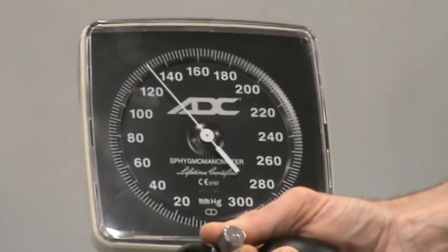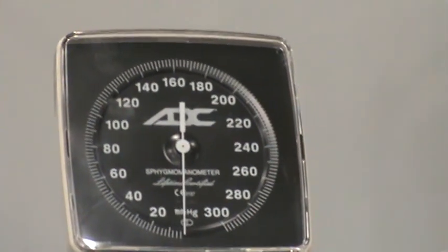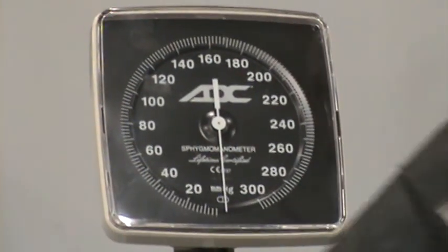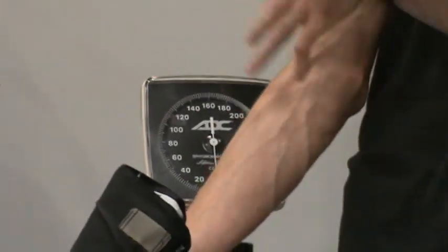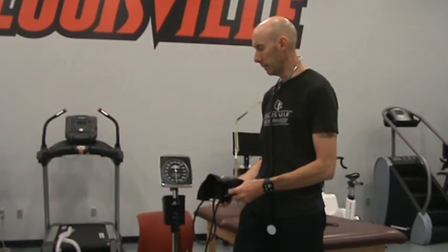The speed the needle drops is also a very key thing. If you go too fast, you're going to miss the beats. Okay, if you go too slow, you're going to create a lot of discomfort for your subject, which you want to avoid as well. So the speed that the needle drops is another thing that is, again, developed through practice often, and it takes you a few times to get the hang of it, okay?